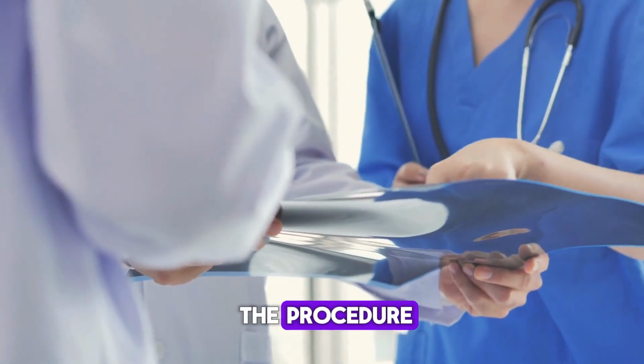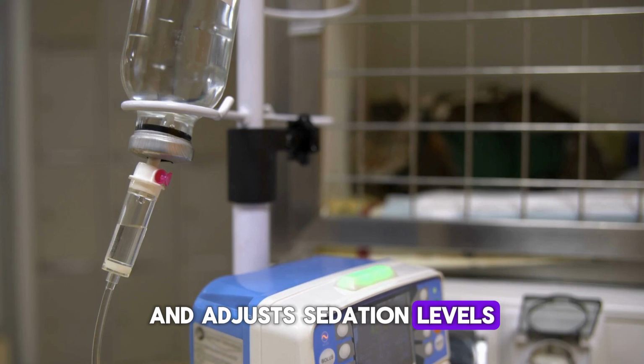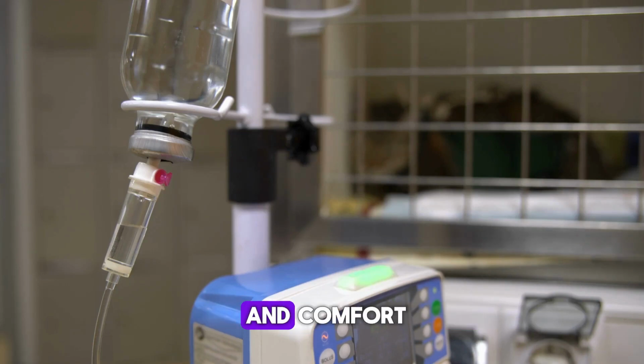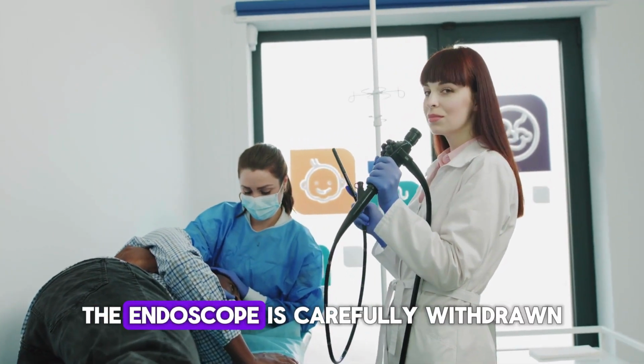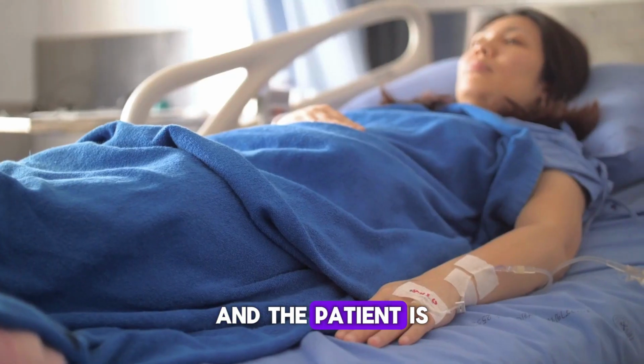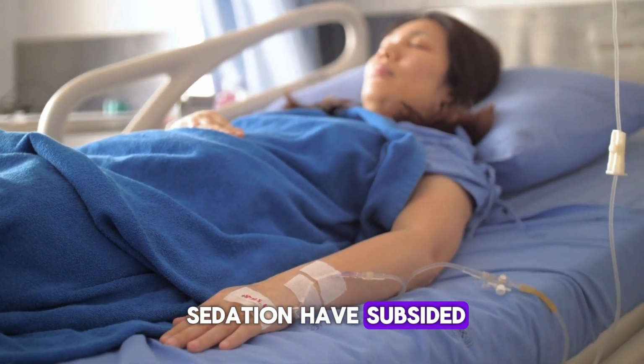Throughout the procedure, the healthcare team closely monitors vital signs and adjusts sedation levels as needed to ensure patients' safety and comfort. Once the examination is complete, the endoscope is carefully withdrawn, and the patient is observed in a recovery area until the effects of sedation have subsided.